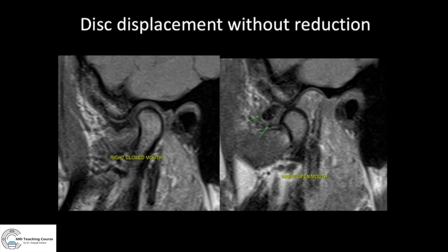Regarding the retrodiscal layer: it is normally slightly hyperintense, but when it appears significantly hyperintense and you don't find another cause of pain, that itself can be the cause — because you can have hyperemia and inflammation in the retrodiscal soft tissue. Also look at disc shape and intensity: this right disc is significantly degenerated and has a central perforation, compared to the normal-appearing left disc. So the disc may show abnormal shape and intensity.